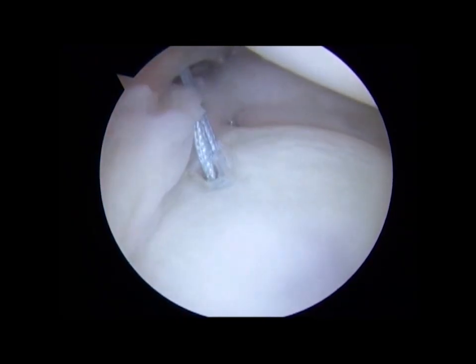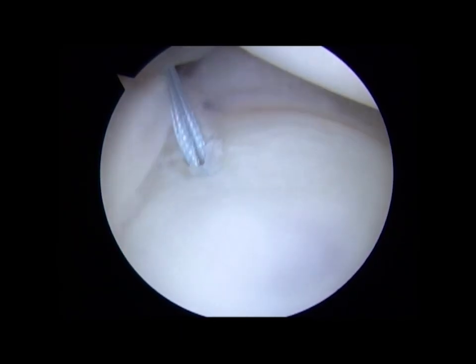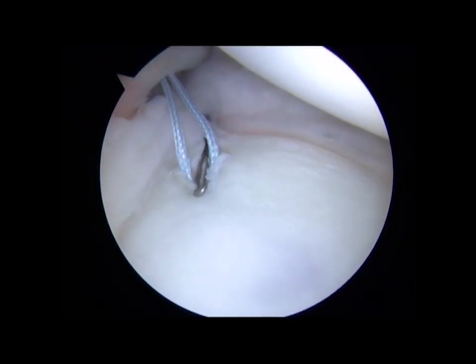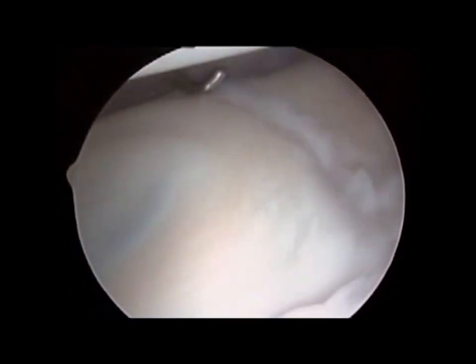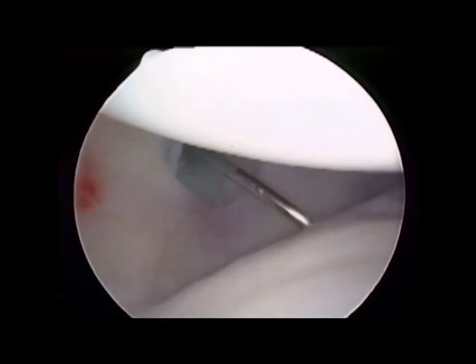Again, the labrum can be undersized and in this case, as mentioned, is not detached, making this incorporation quite difficult. And as we can see here, once the device is retrieved, minimal, if any, of the labrum is actually incorporated. So another technique, a labral sparing capsulorrhaphy technique, is shown here.